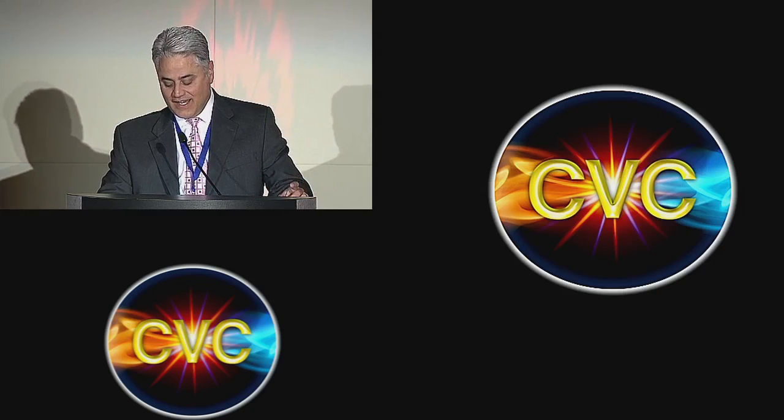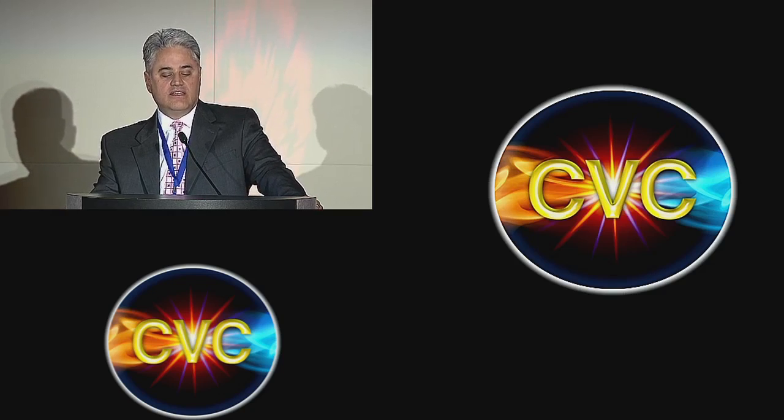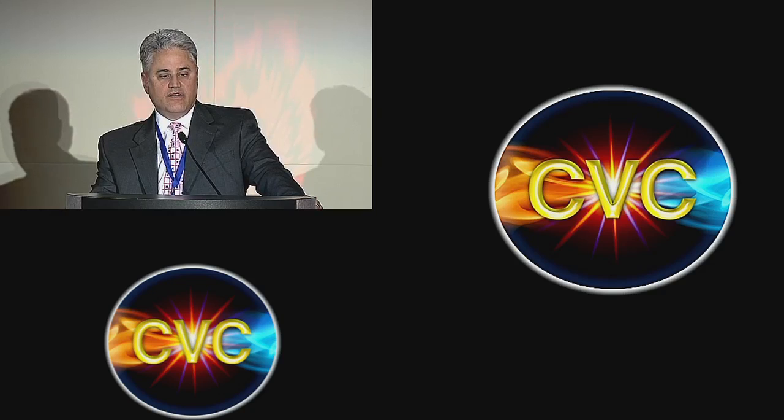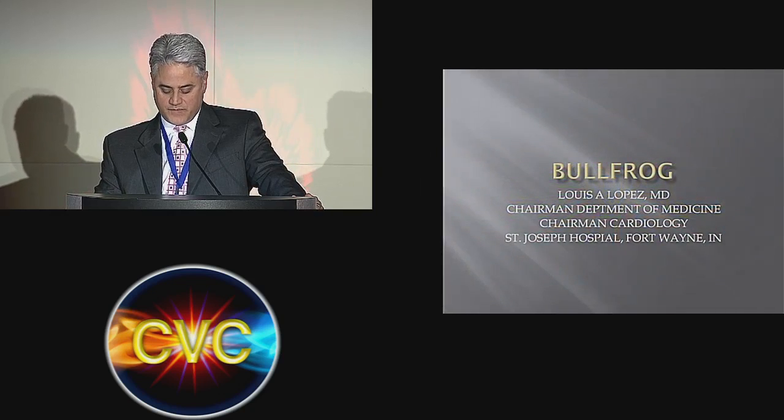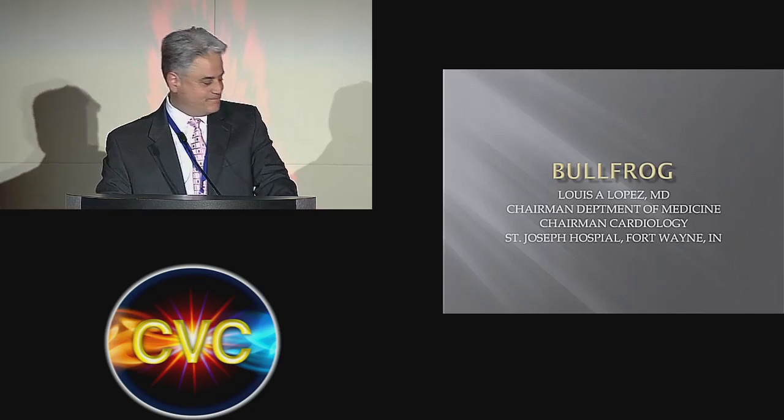But if there is thrombus, then I think extending the area of disease with a Viabahn covered stent is an excellent way to treat that as well. So with that, I will thank you for your attention.